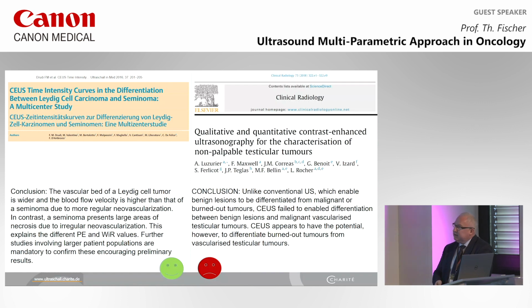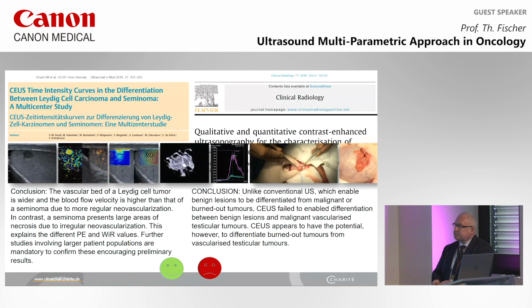But I think we should integrate all this fancy stuff of our multi-parametric approach to get in touch with this very special topic. And for our patients, you see an example of a so-called Leydig cell tumor, where we have an organ-sparing surgery. We excise the tumor, and the diagnosis was done before. And of course, we have to correlate this with an analysis of the tumor after the operation. But this works very well, in my opinion.